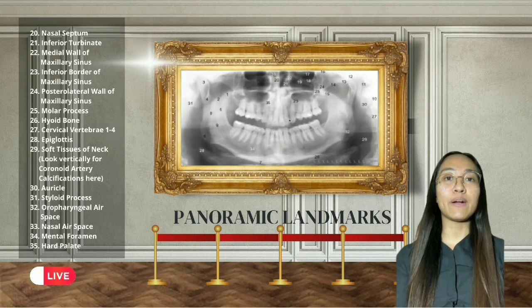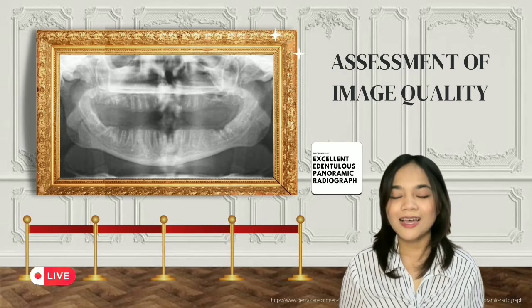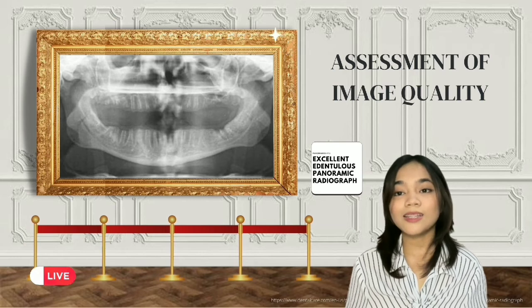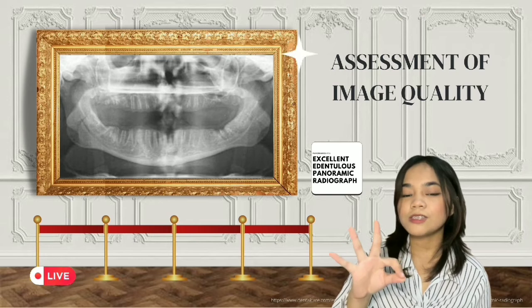Now, let's go to the last part of the tour, and I hope you guys are still having fun. So for the last part of our tour, we will learn how to assess the quality of the radiograph. When we are assessing the quality of a radiograph, there are 3 different stages.